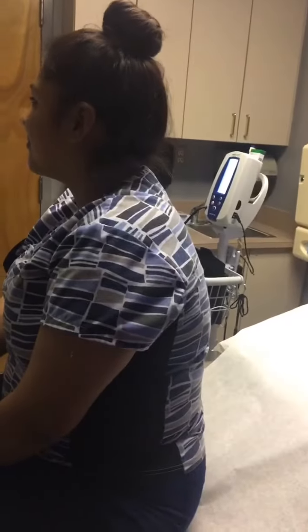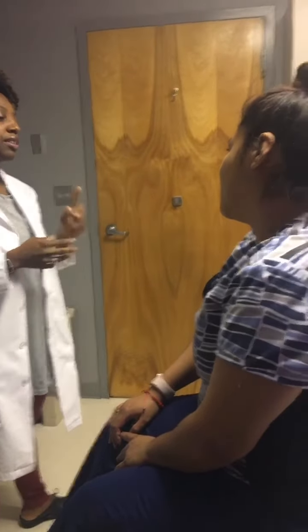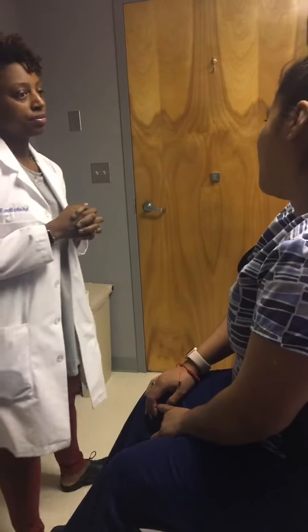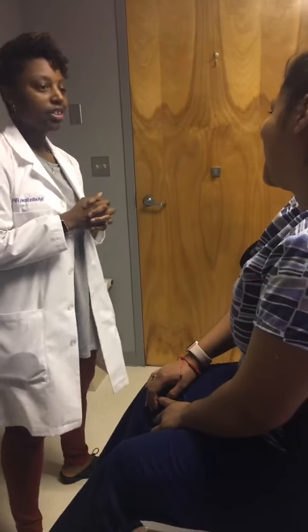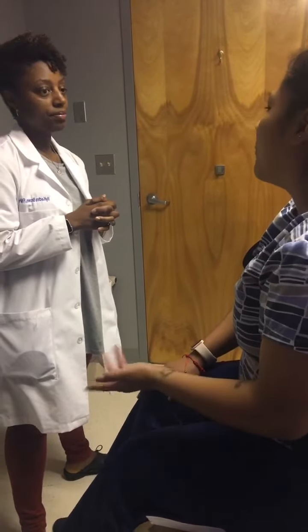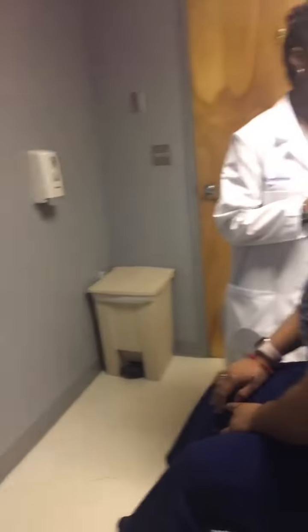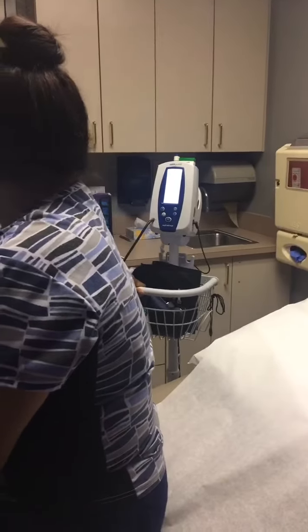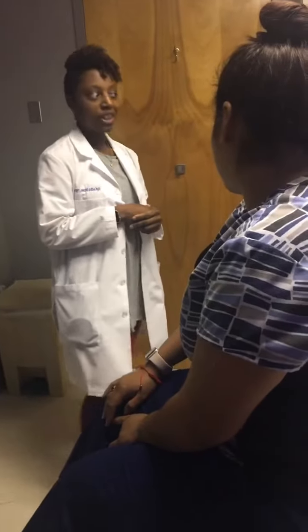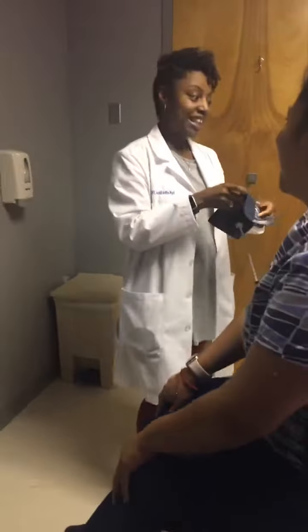Can you talk to me while we're doing this? How long have you started your exercise regimen? Because we talked about exercise earlier — so when did you start exercising? Maybe two weeks ago. Do you have any goals for your exercise routine? Just be more active, be more motivated to do it. Activity is best. So we have a blood pressure here of 111 over 71, pulse of 73. Any idea what a normal blood pressure should be? 120 over 80 is normal. So you are actually doing fairly well today — your exercise must be helping. That's exciting.